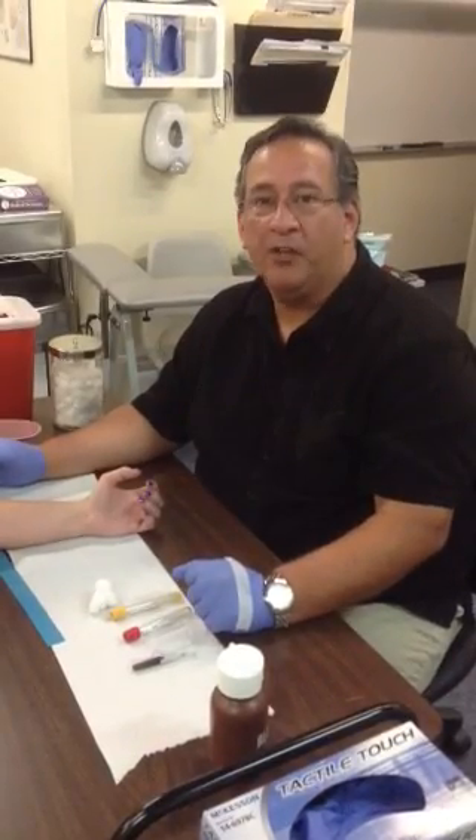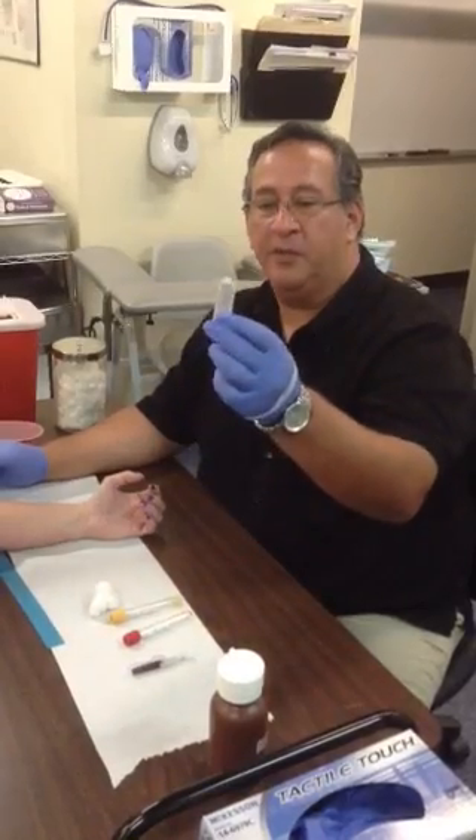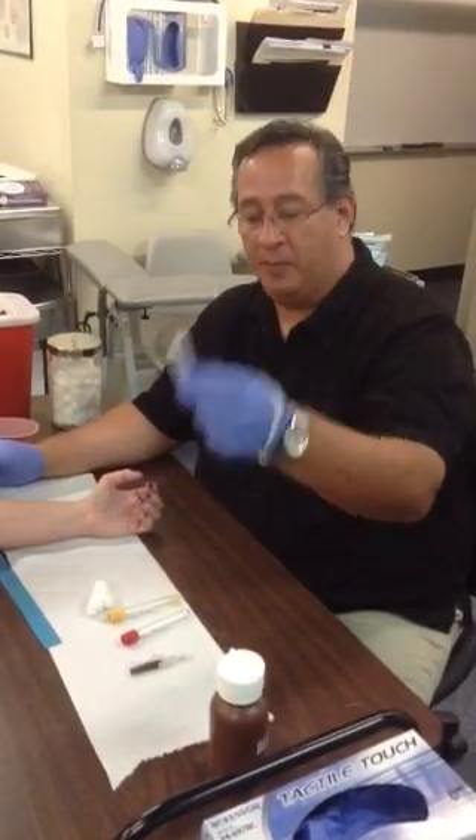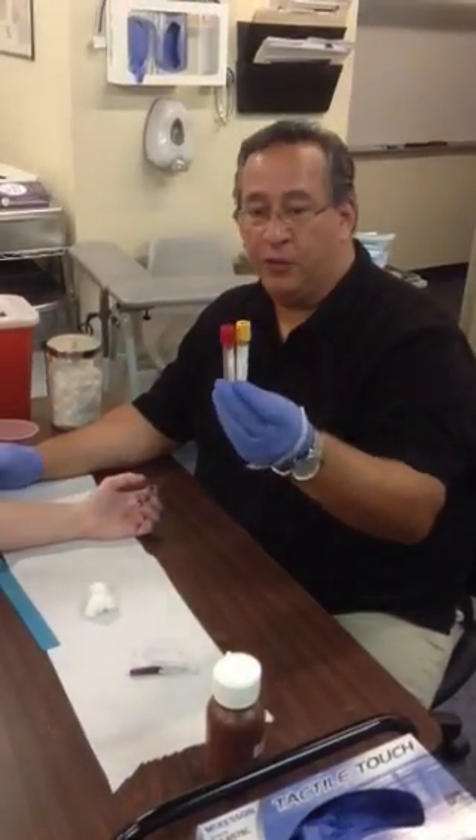I'm going to demonstrate how to perform a venipuncture using a vacutainer system. The vacutainer system uses a vacutainer adapter and a vacutainer needle along with the vacutainer tubes.